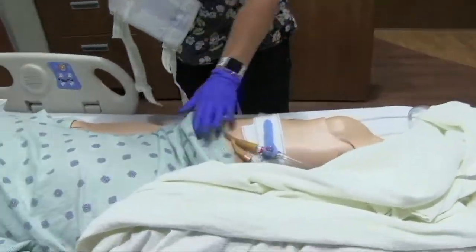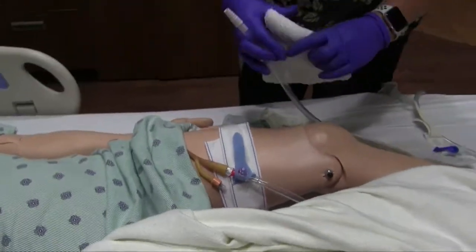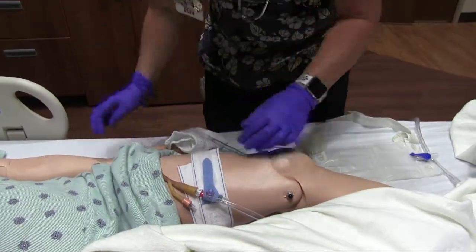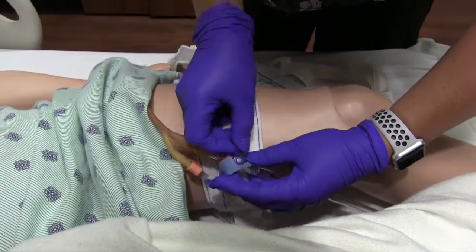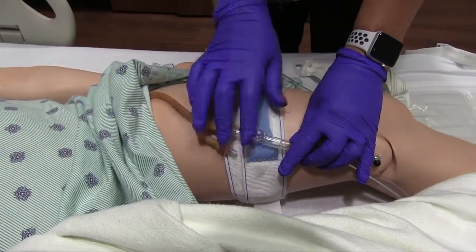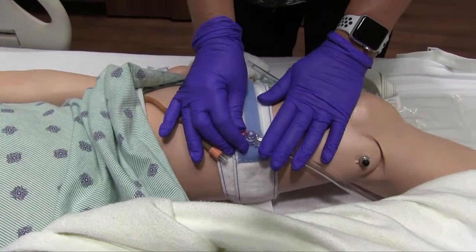So as you see, you already have your leg strap on for your catheter at home, and now I'm going to show you how to switch this over. So the first thing that I generally do is I go ahead and unhook this strap. You're going to unhook this blue portion. You can leave this strap there though, because you're going to use it to secure the upper portion of your catheter, because when you have the leg bag on, the securement system is down lower on your leg. This will keep you stabilized at the top, okay?